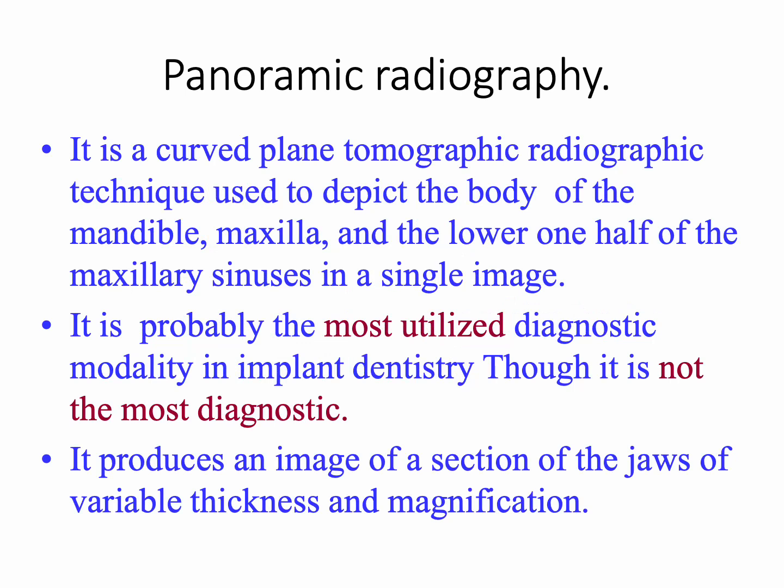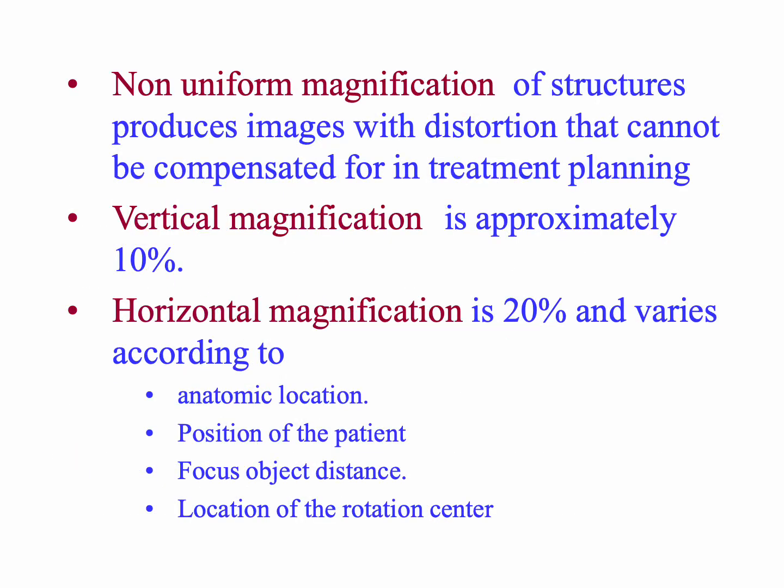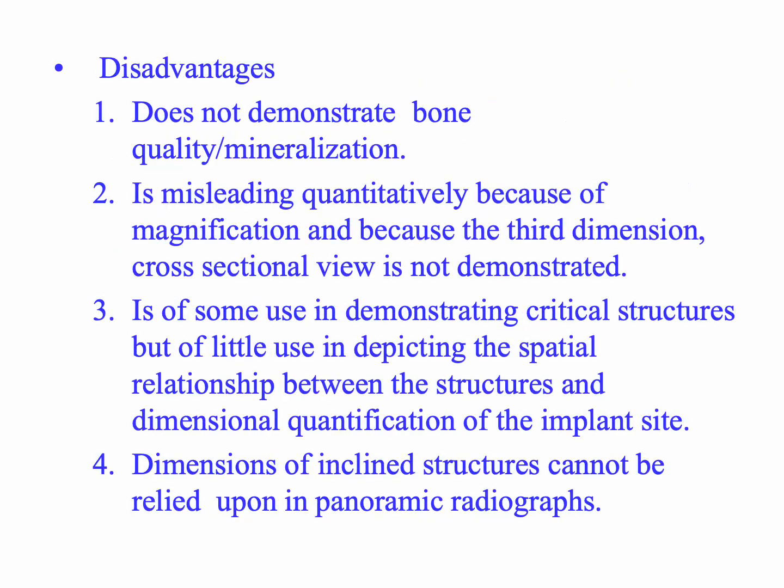Panoramic radiograph is nothing but OPG. It is probably the most used diagnostic tool in implant dentistry. Though it is not the most diagnostic, it produces an image of a section of the jaws of variable thickness and magnification, but it produces non-uniform magnification. A 10% vertical magnification and 20% horizontal magnification is identified with this radiograph.